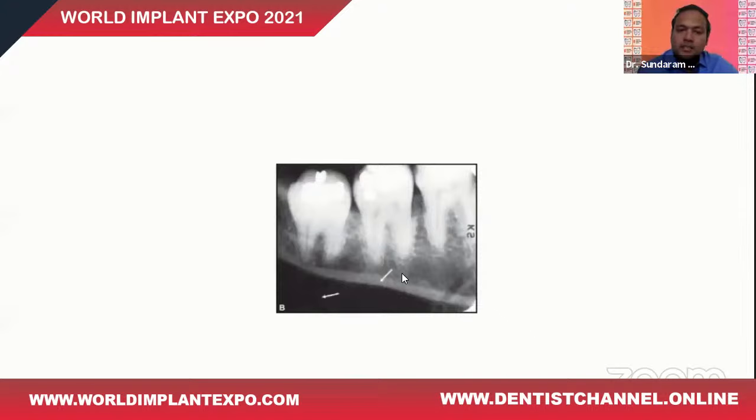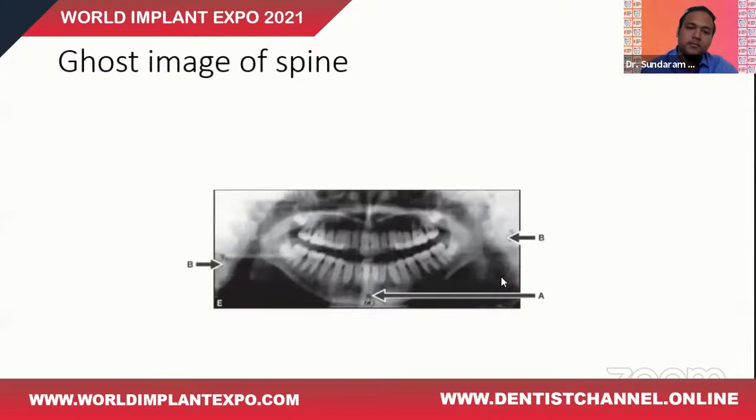Now, what could this be? This gives an appearance as though the mandible body is really thinned out, which is not actually so. This is an image because of improper angulation, and the line that you see over here is actually the internal oblique ridge, and the space that you see below this line is nothing but the submandibular fossa.